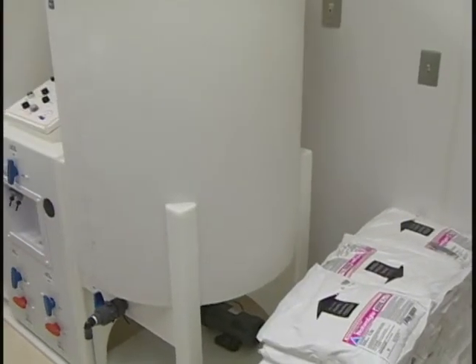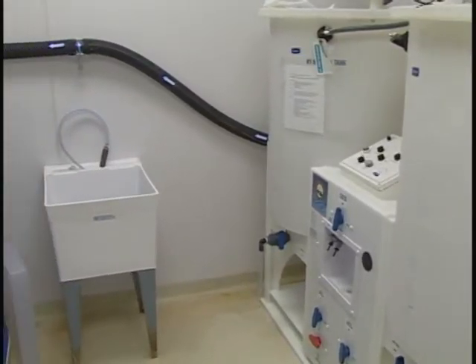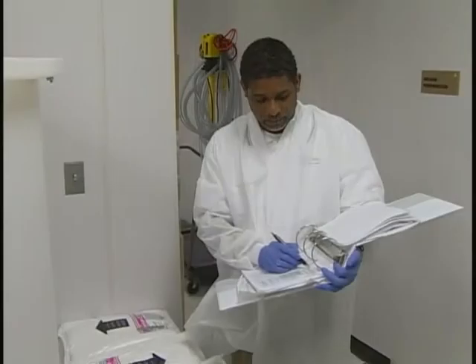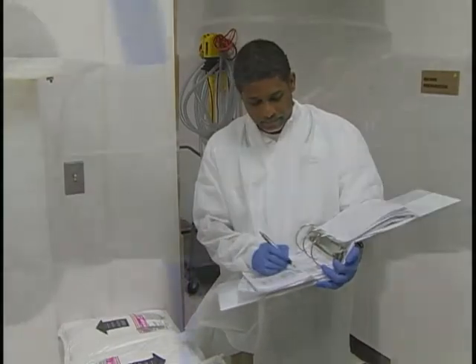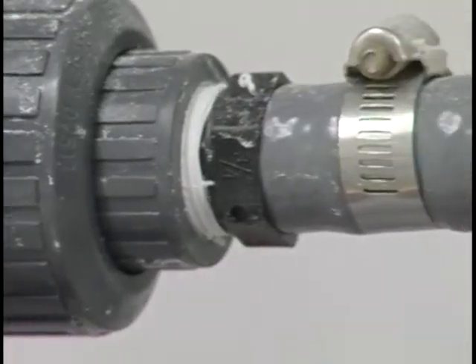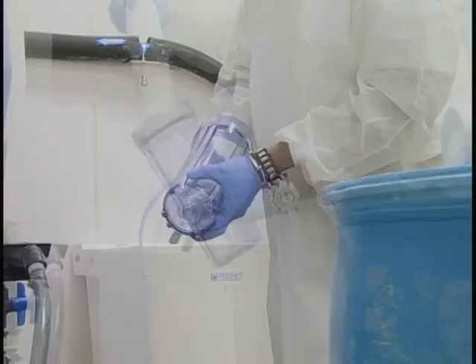As you survey the facility, you will not only be observing to ensure that the dialysate preparation area is orderly, the equipment operational and in good working order, but you will check label dates, note when packages of concentrate mixes were opened, and make certain they are not expired. In addition to being susceptible to contaminations, the acid and bicarbonate concentrate solutions are highly corrosive. Your survey tour should confirm that the facility's mixing system equipment is designed and maintained to help prevent corrosion development.